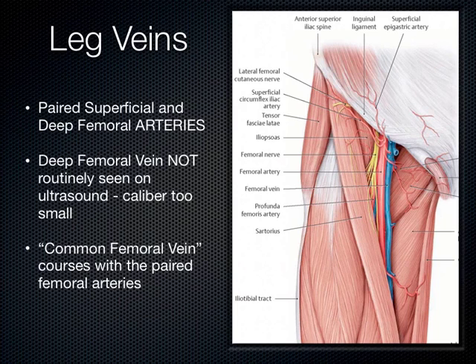Essentially, you've got that in the inguinal area up there, sometimes called the inguinal canal, right along here. This is the inguinal ligament going along here, okay? You can see some muscle bellies here. But this is the orientation: the femoral nerve, and then the femoral artery, and then the femoral vein is seen medially to it. The way I remember that the vein is more medial than the artery is the rhyme: venous rhymes with penis. Good, venous penis. Someone, you heard that one already. So you could say venous vagina if you wanted to too. Sometimes people say other things, but I think that's just easy to remember, kind of rhymes: the most medial structure would be the vein.